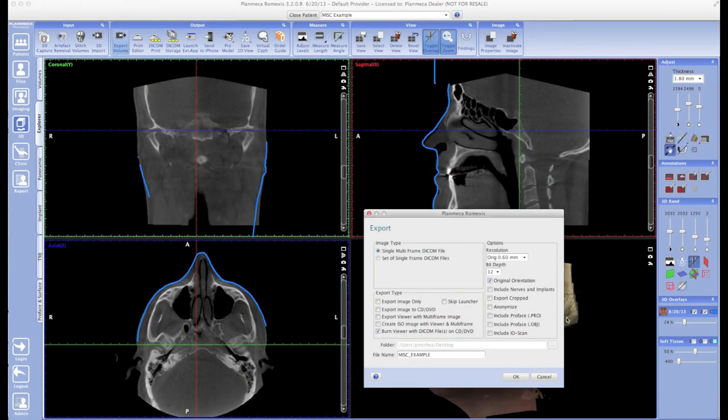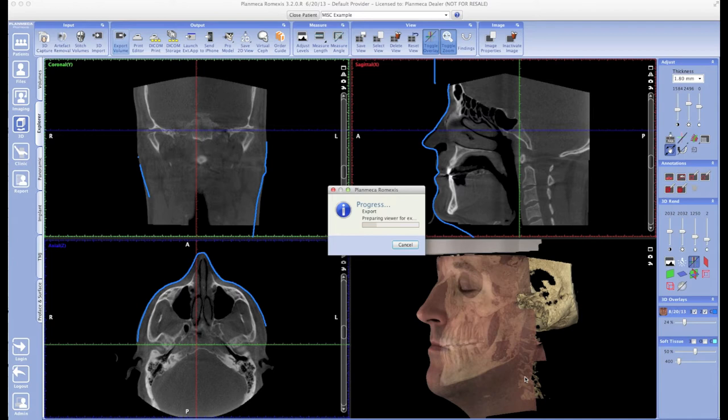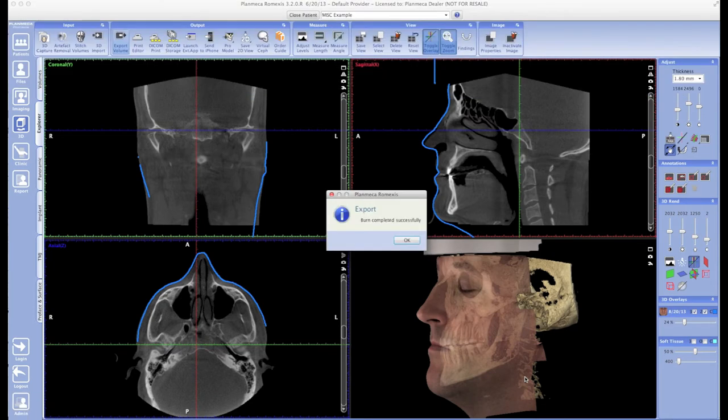Burning a disc can take anywhere from four to six minutes. This one in particular took about four and a half minutes—it's completely normal for it to take that long. I sped this part of the video up for convenience. Now, the discs are both Macintosh and Windows compatible, so all the user would have to do is pop the disc into their respective computers and double-click the Romexis viewer icon.